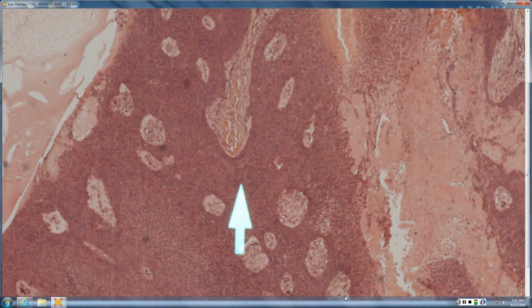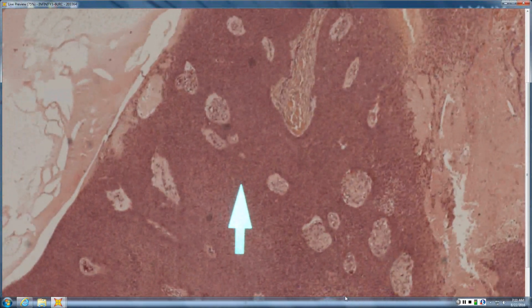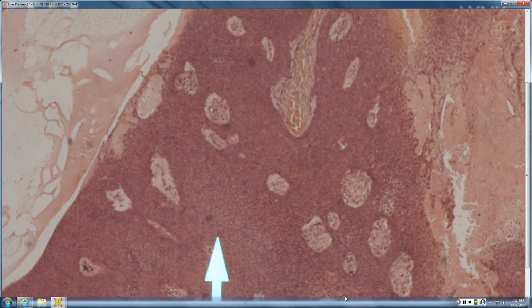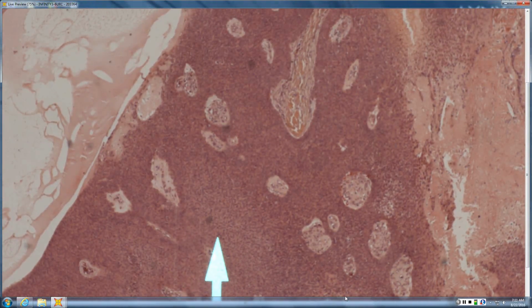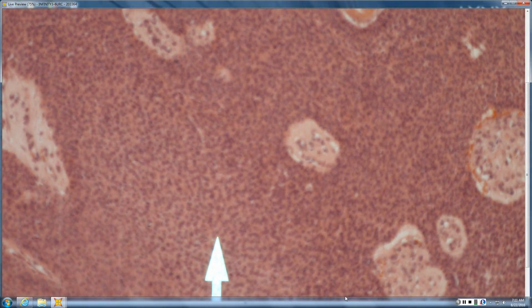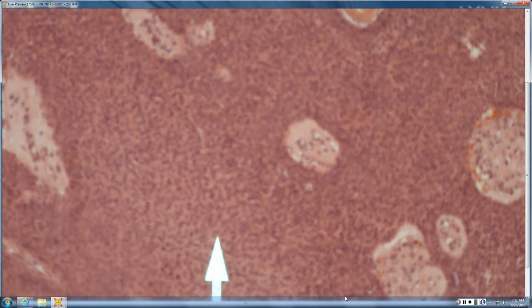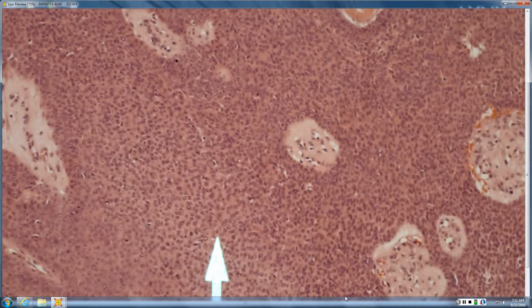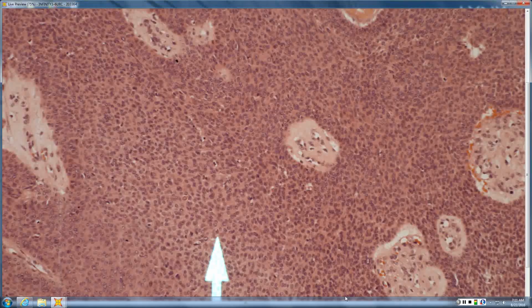And so when you get in a little bit closer, it's not like they're dirty, they're not pleomorphic. They're just these monotonous cells, almost in a sense akin to glomus tumor, how they're just these little monotonous little nuclei. They all seem to be evenly spaced. They have very well-defined rounded or cuboidal nuclei. And so this is just the poroid appearance, or hidradenoma cell appearance. And it takes some time, again, just to see these over and over again. But once you start to really get that look, you're like, oh, this is in that poroid box, and it's not a basal cell or a squamous cell or something else.